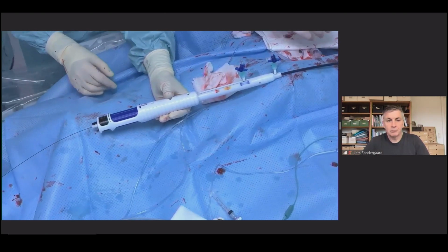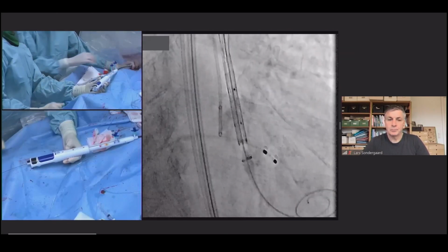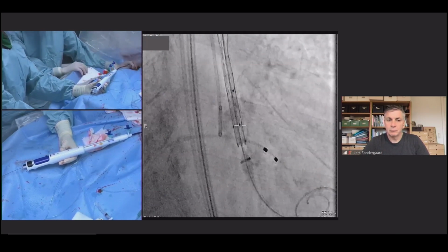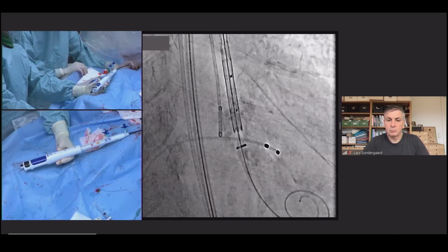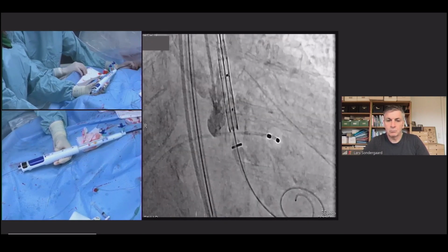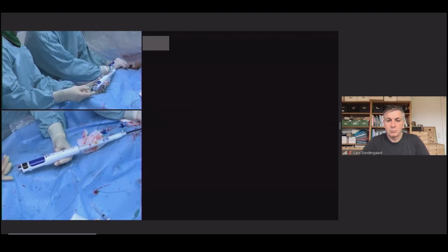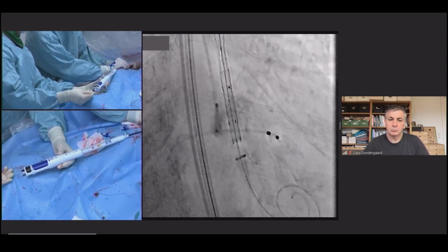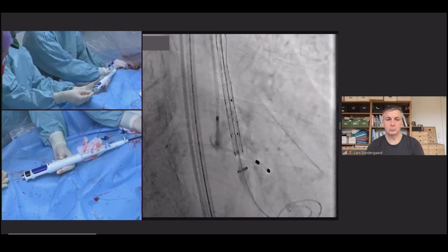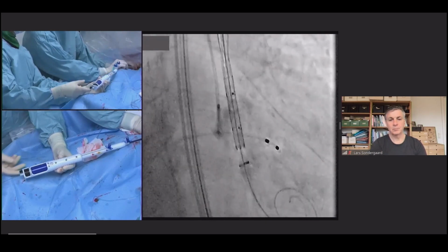So maybe we should just start here. We'll just have an injection to see where we are, because there's quite a lot of calcium. There's a risk that the pigtail is not sitting all the way down in the bottom of the cusp. You see there's a chunk of calcium a little bit lower. You can use the calcium as a marker as we deploy, instead of injections, actually. So we should probably go a little bit lower. I think that will be an ideal position to end up in if you can. Okay, that's a good spot to start.